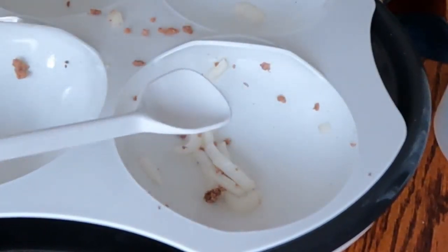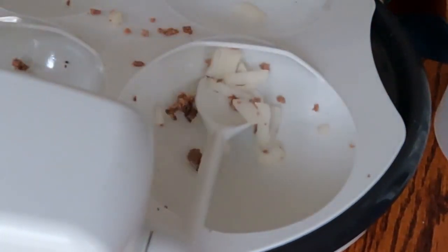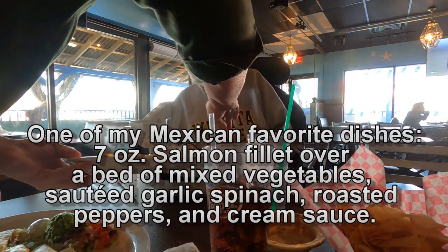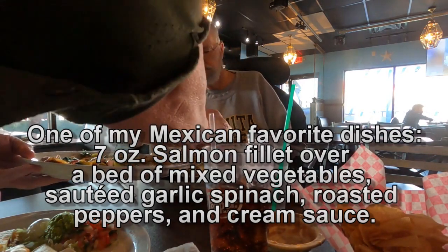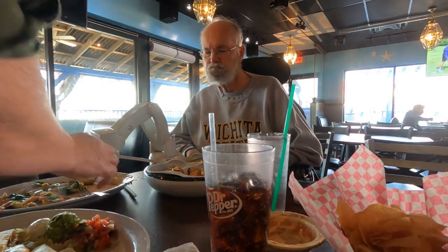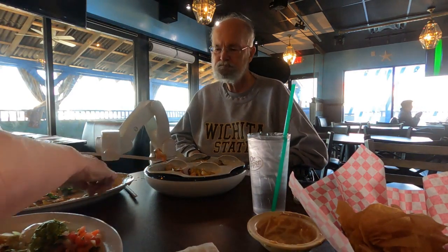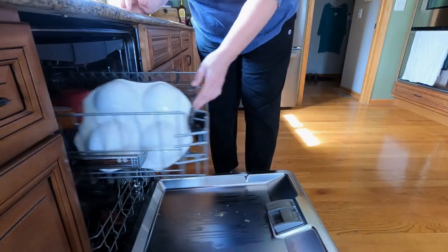OB also has the ability to reposition remaining food items left in every food compartment. Taking OB out to a restaurant also works nicely, but be prepared to be asked questions by others dining around you. For use at home, all food serving containers and spoons from both devices are dishwasher and microwave safe. During a restaurant visit, ask your waitress to rinse off the plate or carry a plastic bag to wrap the plate in for the trip home.